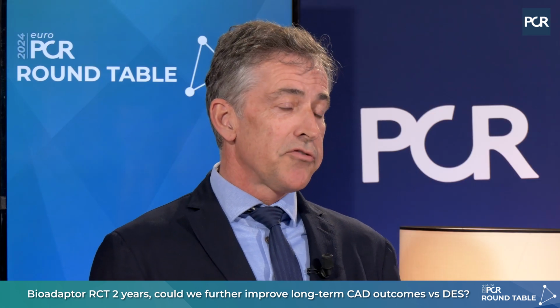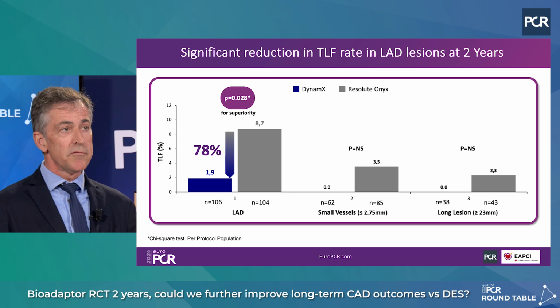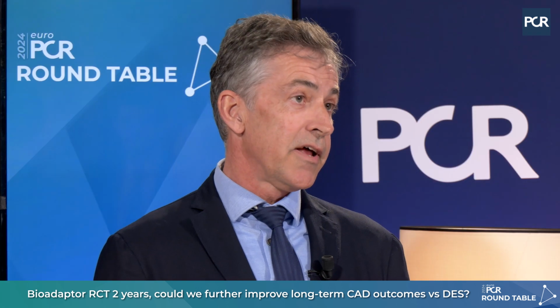I don't know, Stefan, if you have other candidates to be considered? Yeah, what I would like to add, especially based on what we've seen in the 2-year data now here, is that in LAD lesions, you have a 78% reduction in TLF, which is unseen and unheard of, compared to the comparator, an almost 80% reduction in TLF. So that's significant. And if you look at TVF, target vessel failure, you also see a 65 or 68% reduction compared to the comparator. So basically these, I would say LAD lesions, long lesions like Antonio said, younger people, those are the ones where you have this possibility. And especially those vessels where you have most rotation, LAD, RCA, those are prone to have more events. And I think that's a suitable platform for that.